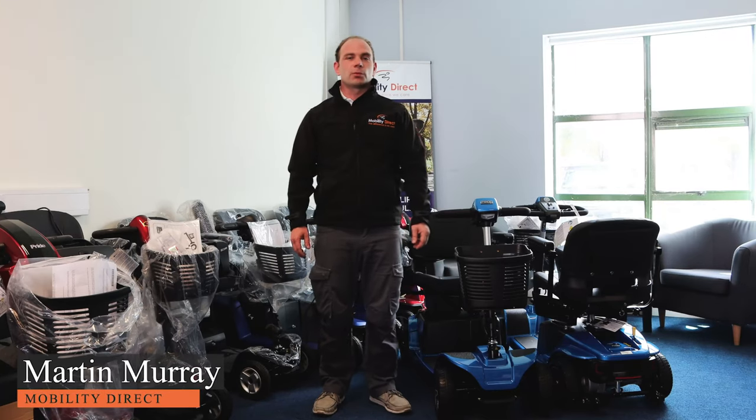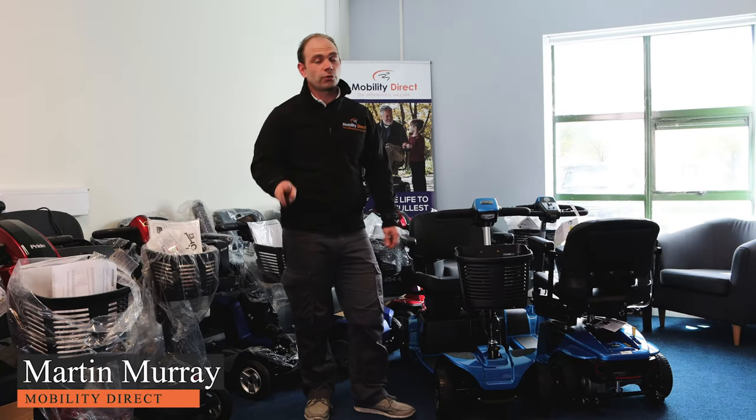Hey folks, Martin here from Mobility Direct. Hope you're keeping well. If your mobility scooter isn't working, here are three things that you can check.